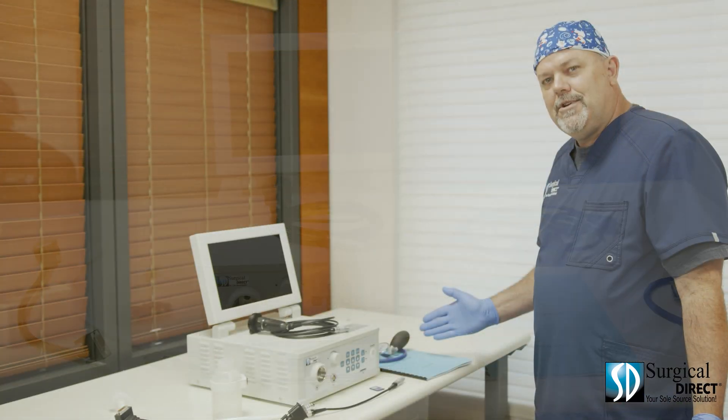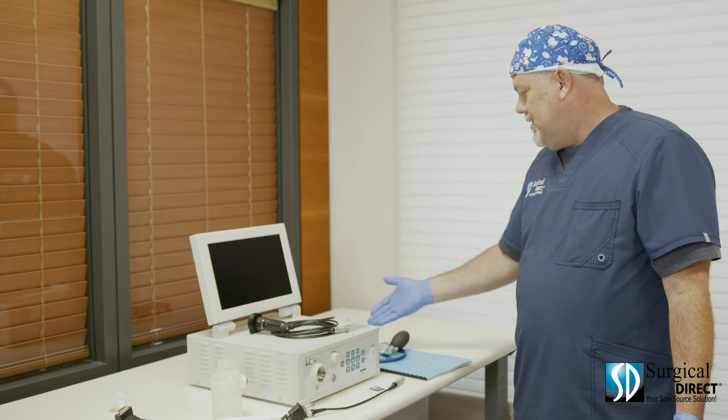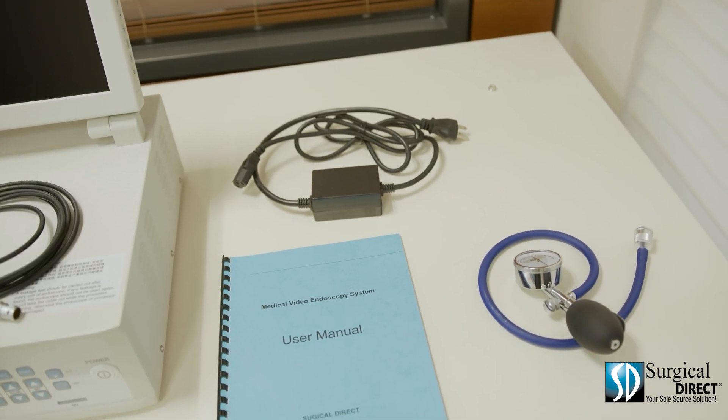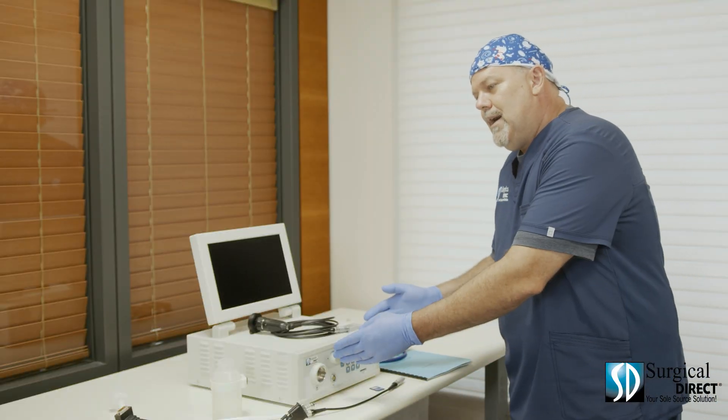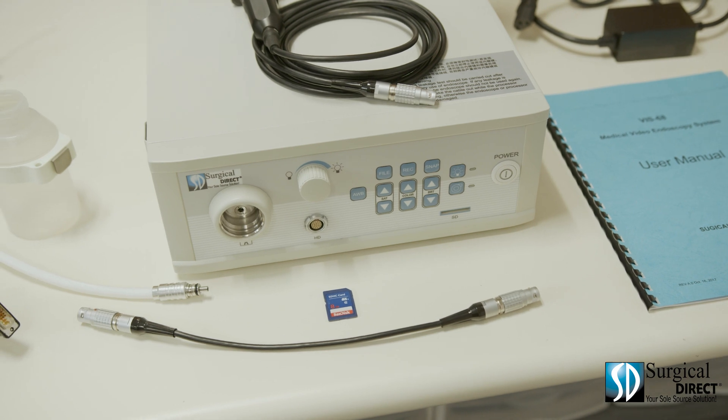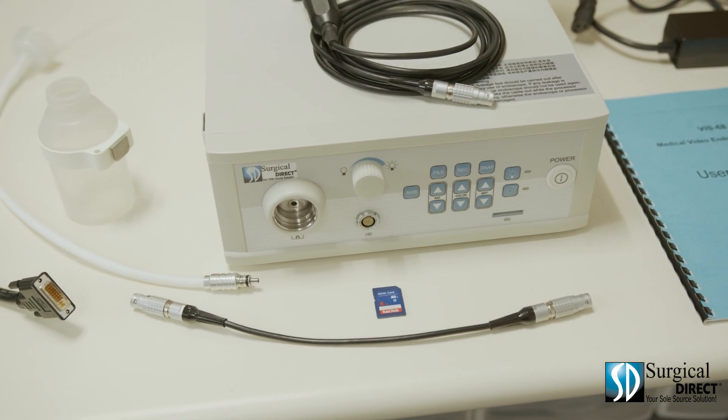These are the items that are included with our Veterinary Endoscopy System: a power cable, a leak tester, the manual, the control box, a camera head, an SD card, a water bottle, and a video cable.